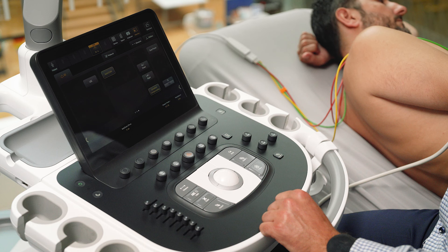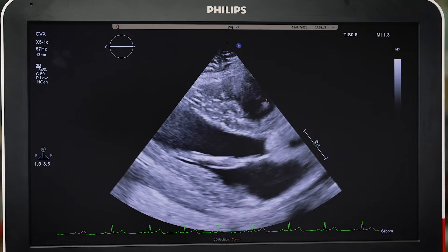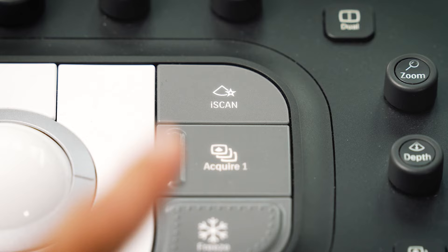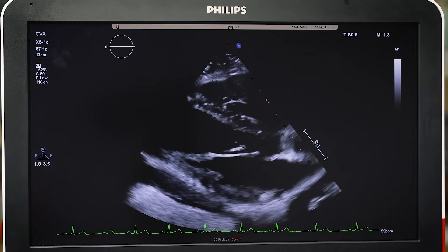Autoscan automatically and continuously optimizes the 2D image brightness at the default gain and TGC settings when selected.